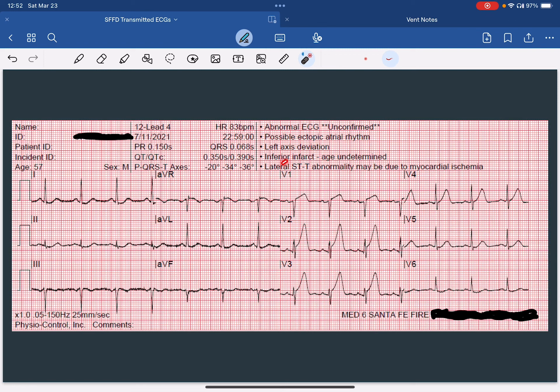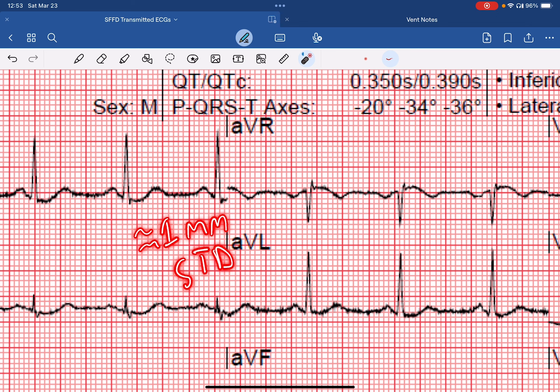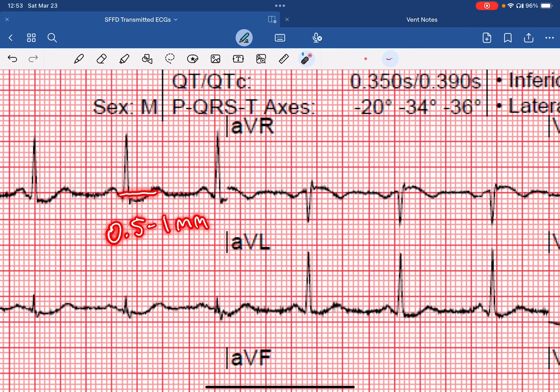Looking at our lateral leads — leads 1, AVL, and V6 — we can, in fact, see that there is a little bit of ST depression. Measuring using the T-to-P segment as the isoelectric line, there's about 1 millimeter of ST depression. Using the PR interval as the isoelectric line, there's about 0.5 to 1 millimeter of ST depression.